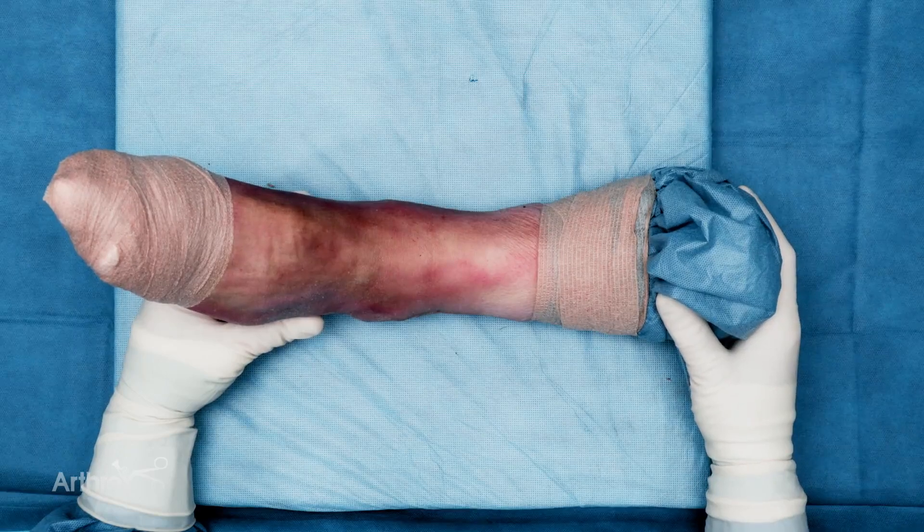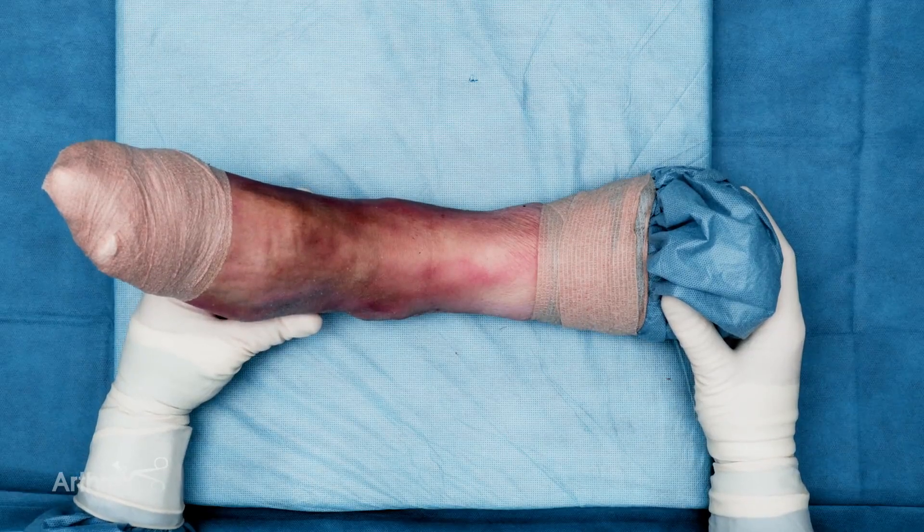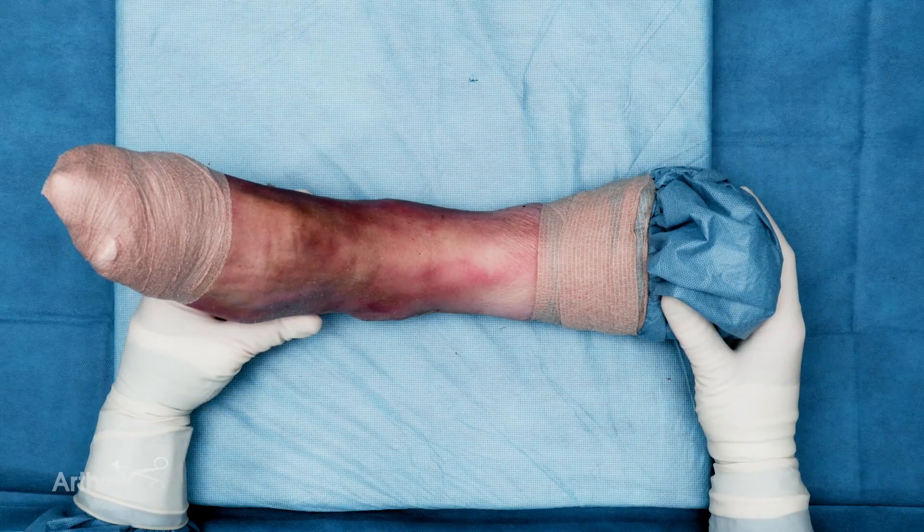This video shows the benefit of using fiber tape cerclage stabilization of a traditional SER type ankle fracture when using the Fibuloc nail.